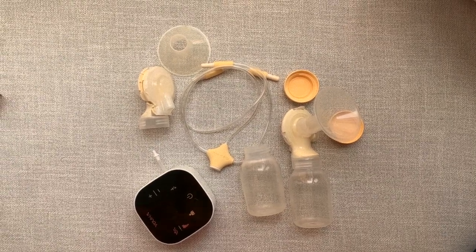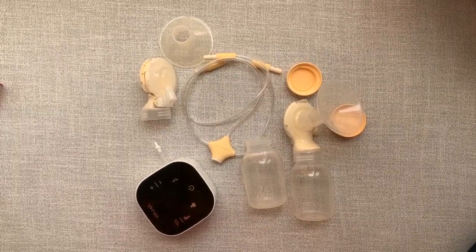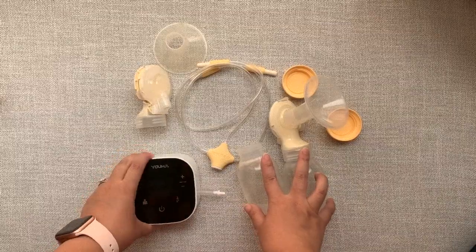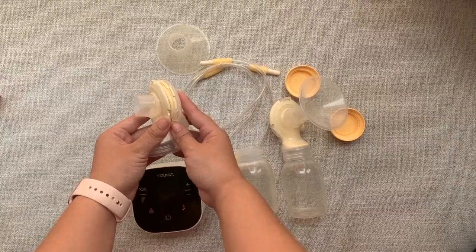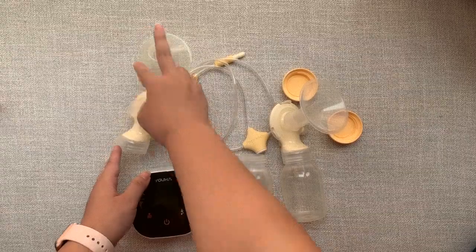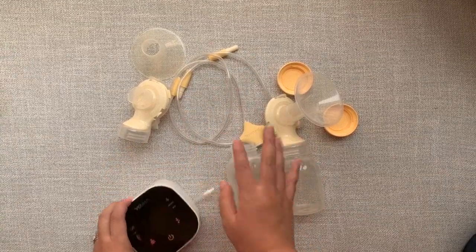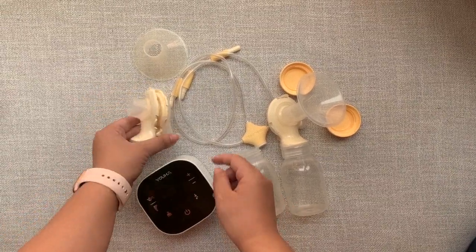Hi, so I'm going to show you today how to assemble the Medela compatibility kit with the Freestyle parts with the Youha The One breast pump. So the compatibility kit at Petite Bee comes with the spare parts, the Freestyle tubing, the flanges, and an adapter, as well as the collection bottles. So this set comes separately to the Youha The One breast pump, and this is how it is assembled.